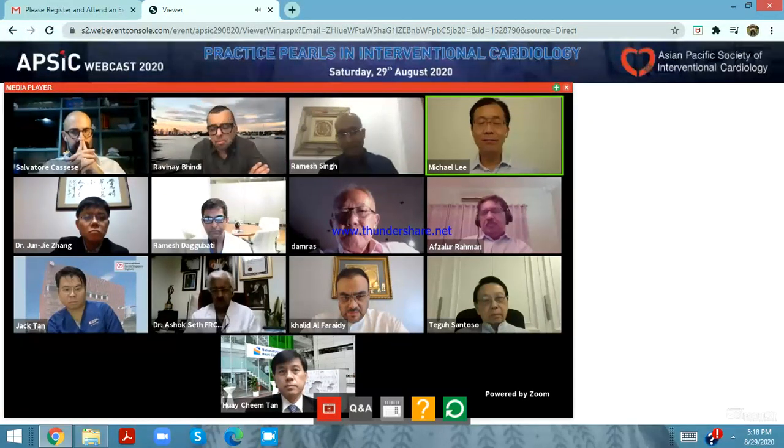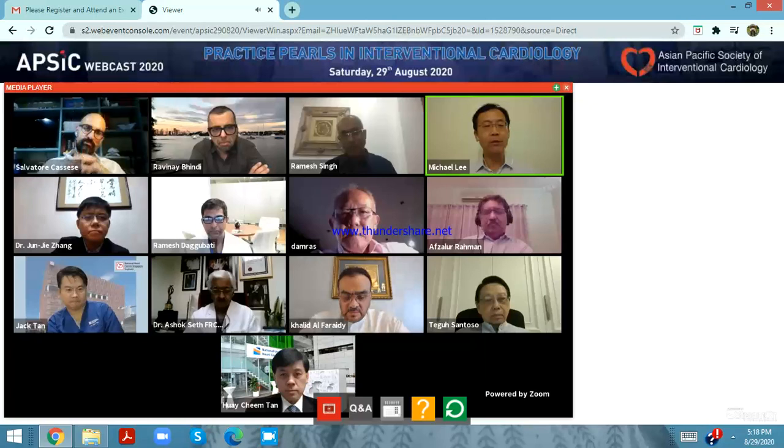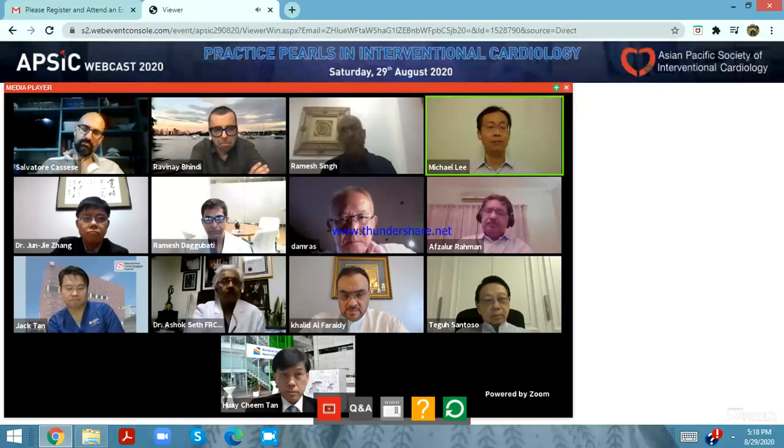Well, thank you very much. First of all, we haven't really seen a perforation as a result of the use of the Shockwave balloon. We see sometimes a rupture of the balloon, but it doesn't end up in rupturing the coronary artery. So it's very, very safe to use, I would say.